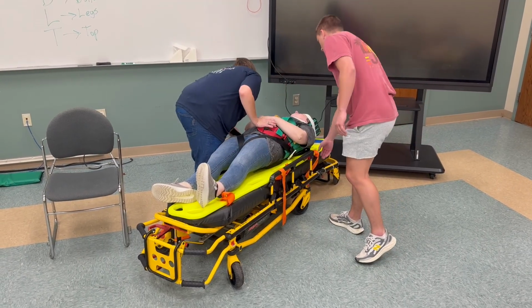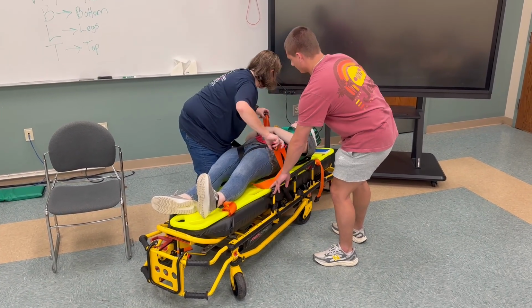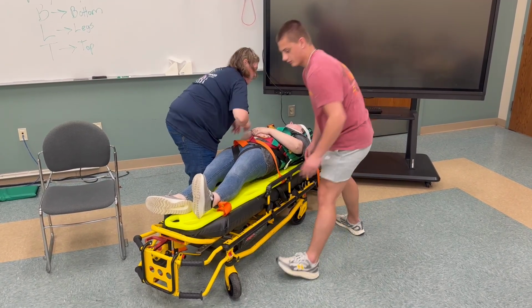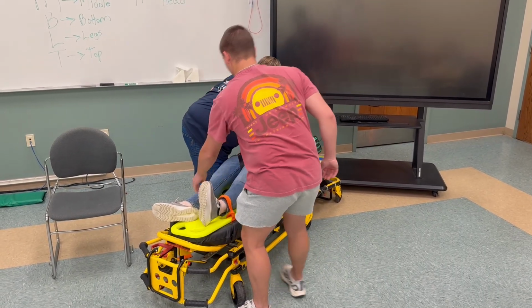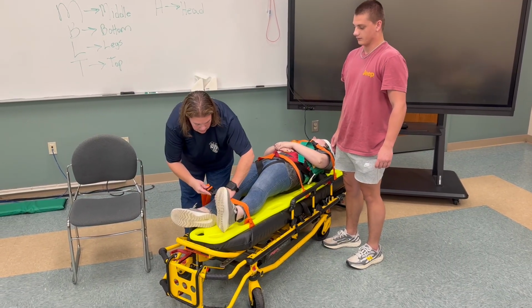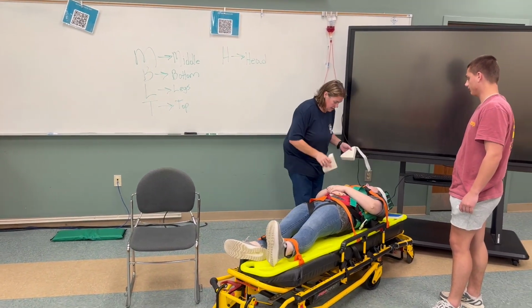So on a backboard, you do chest, legs, and then just like everything else is the head.